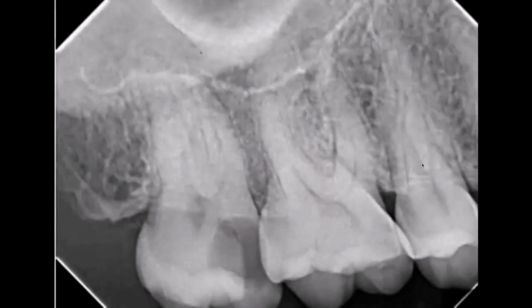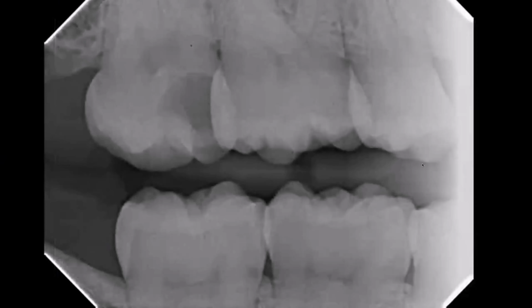This is another example. In some cases, it actually becomes more challenging to try and perform that gingivectomy, rebuild the sound seal in that area, and then remove it, rather than creating a good contact from the beginning and then doing your GentleWave procedure as you would a normal class 1 restoration.